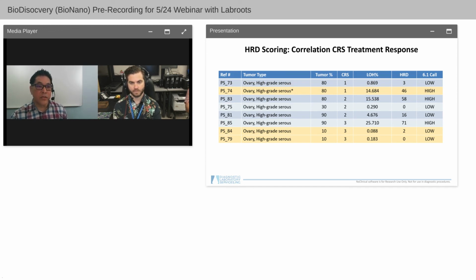And in those situations, all we have from an NGS laboratory standpoint to work with is a small cytologic preparation with a few cells, and a tumor that is pretty much completely destroyed by chemotherapy. So in those situations, there's no tissue available for an HRD assessment if that patient recurred, to see if that patient is available for PARP inhibitor therapy.